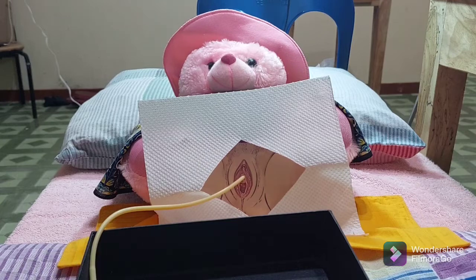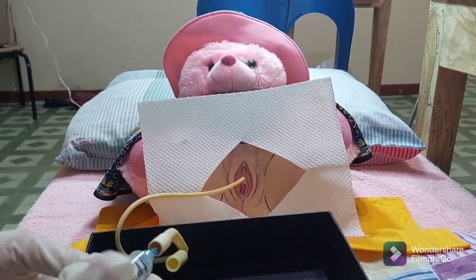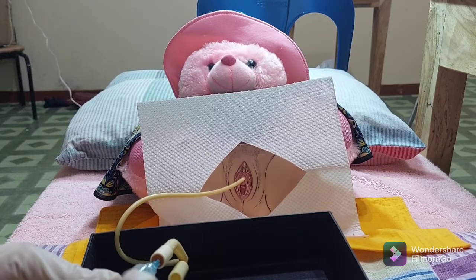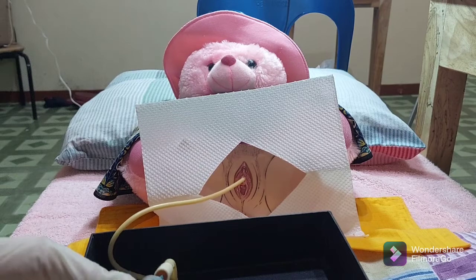After the balloon is inflated, gently pull the catheter until resistance is felt and then advance the catheter again. Moving the catheter back into the bladder will avoid placing pressure on the bladder neck.